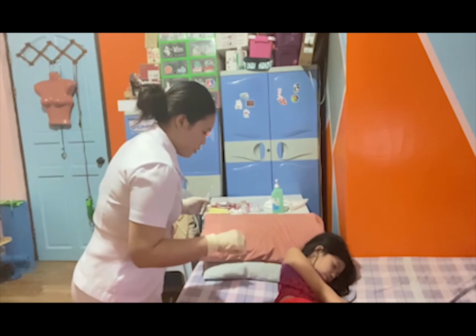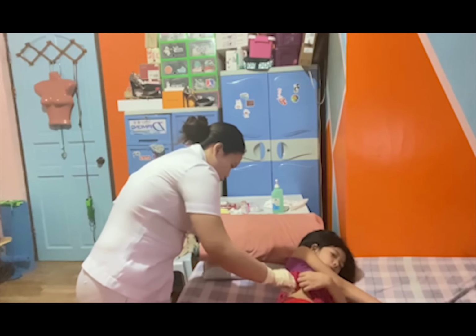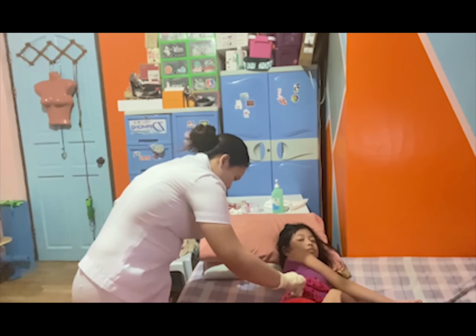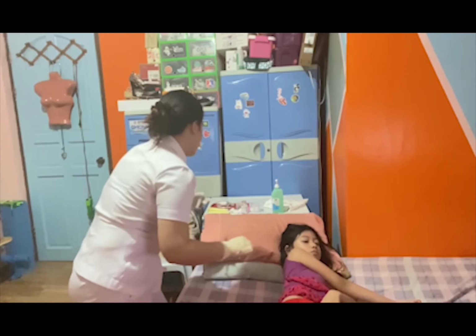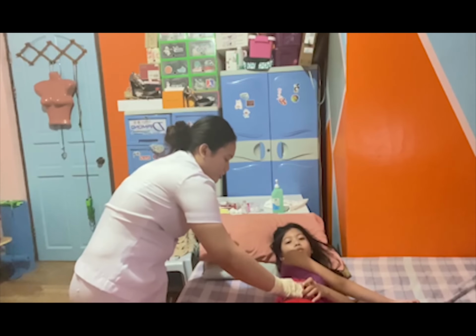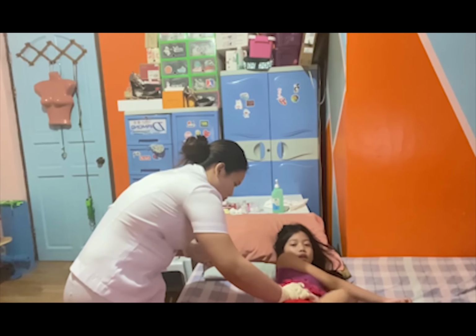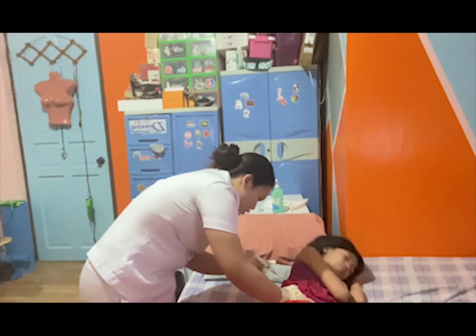Apply a cotton ball soaked in 70% alcohol. And pinch the skin of the patient. Inject it.